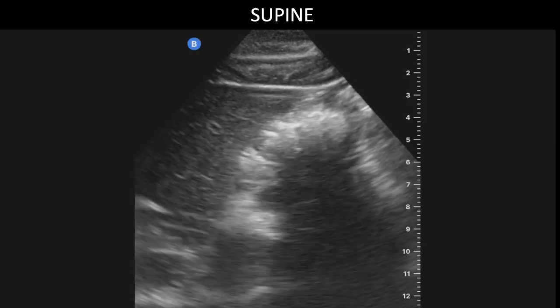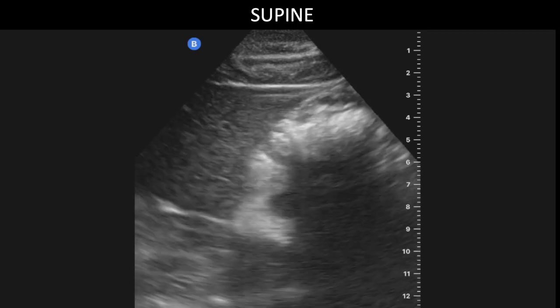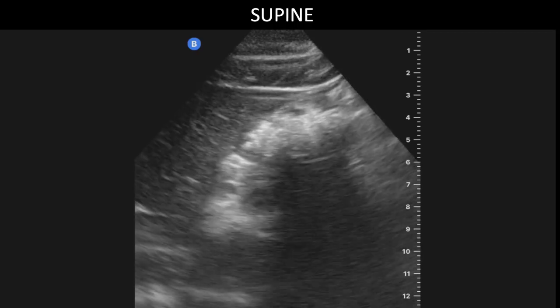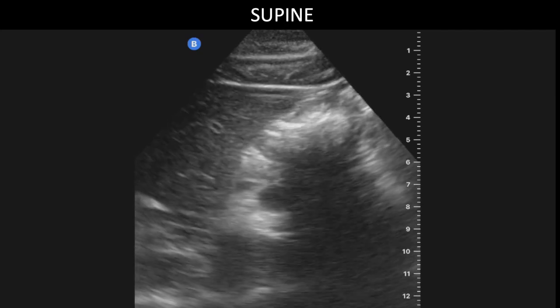Now let's return to our patient. For this patient, the following subxiphoid parasagittal view of the abdomen was obtained with the patient in the supine position.